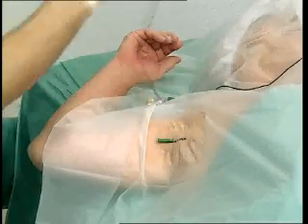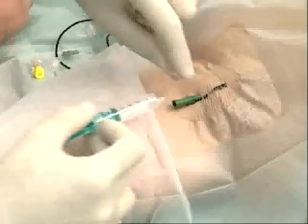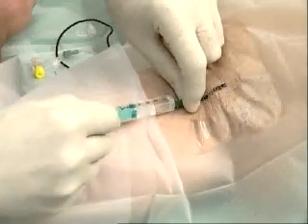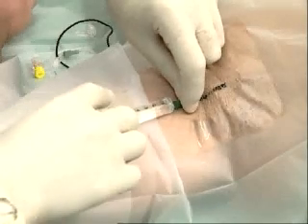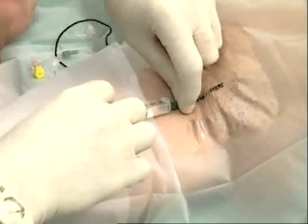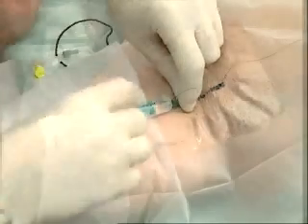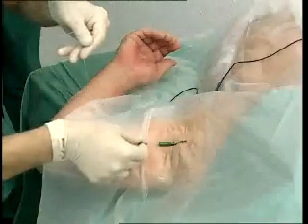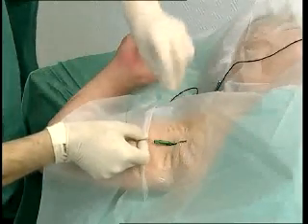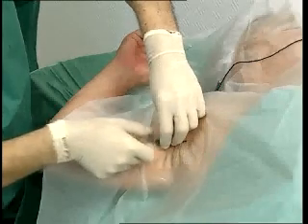Withdraw the stylet. After careful aspiration, inject a 3 to 5 milliliter test dose of local anaesthetic in the neurovascular sheath. Then insert the catheter 4 to 5 centimetres.